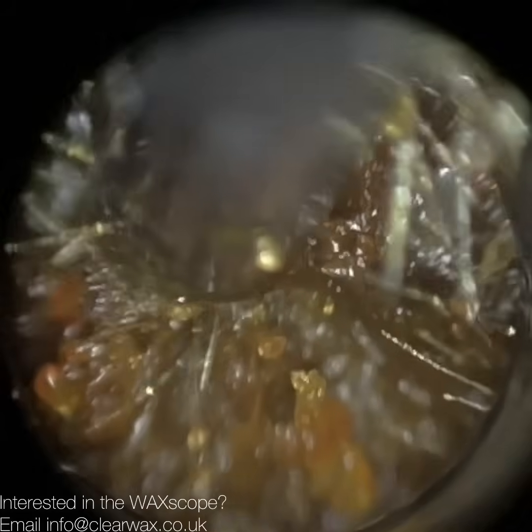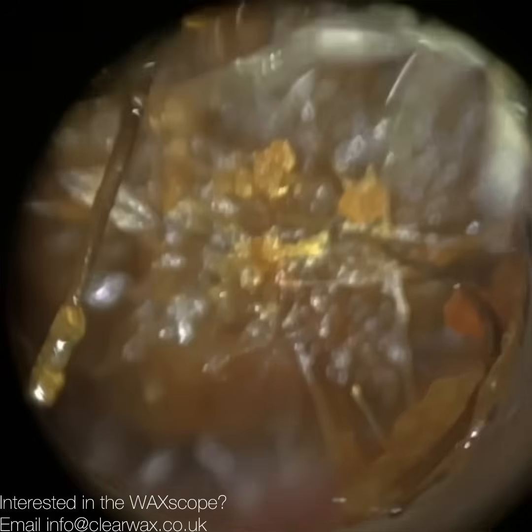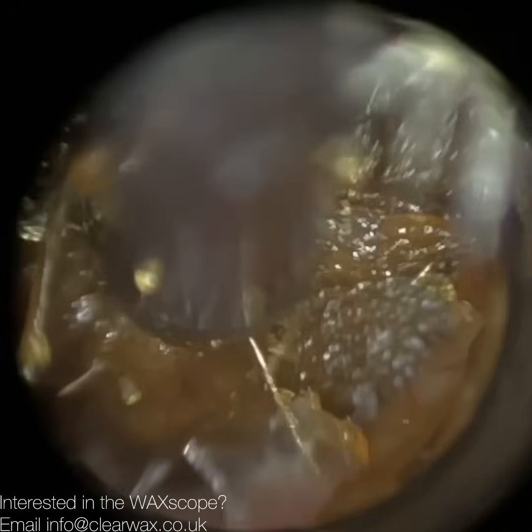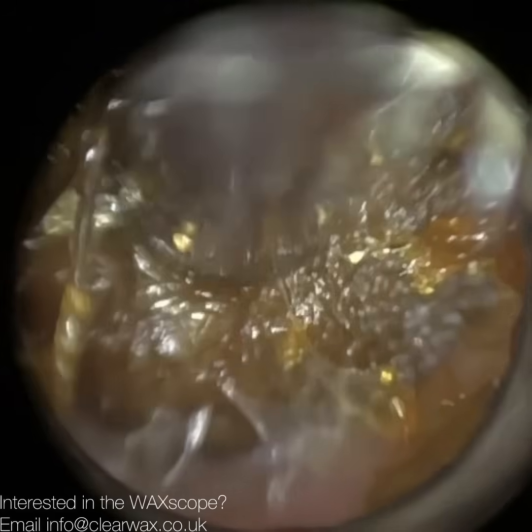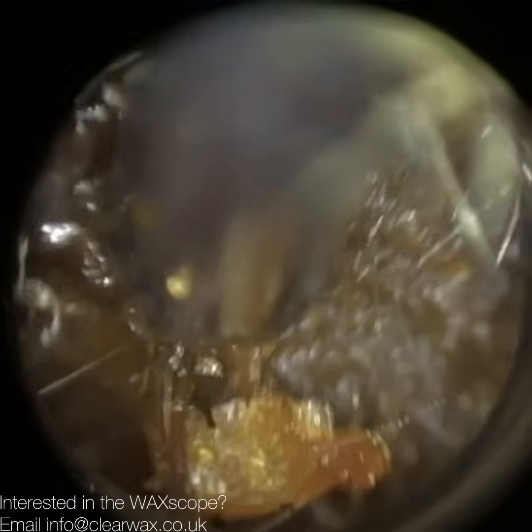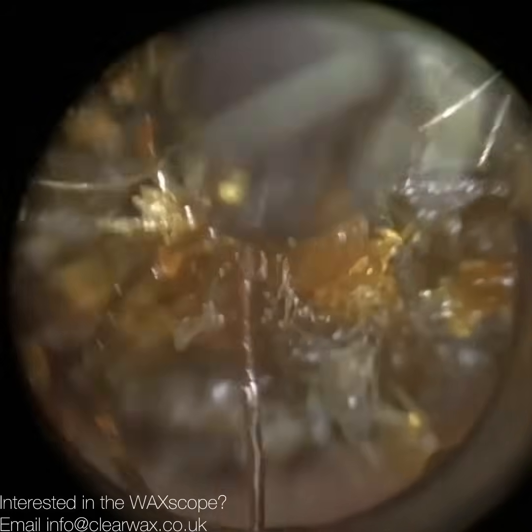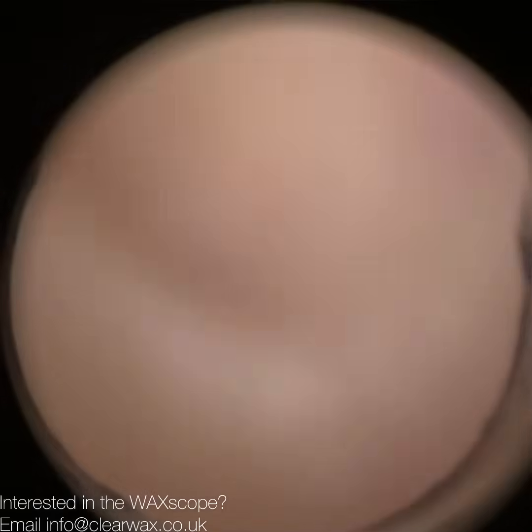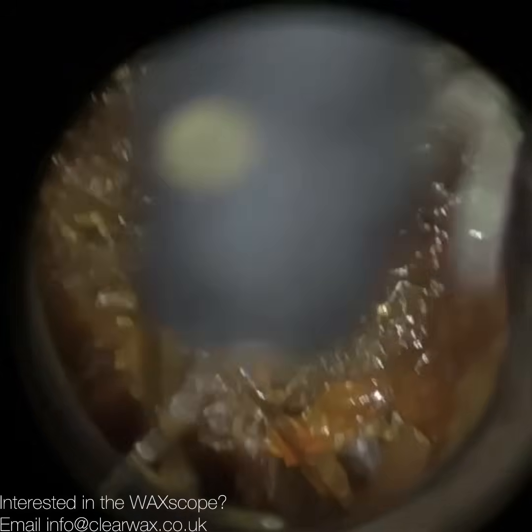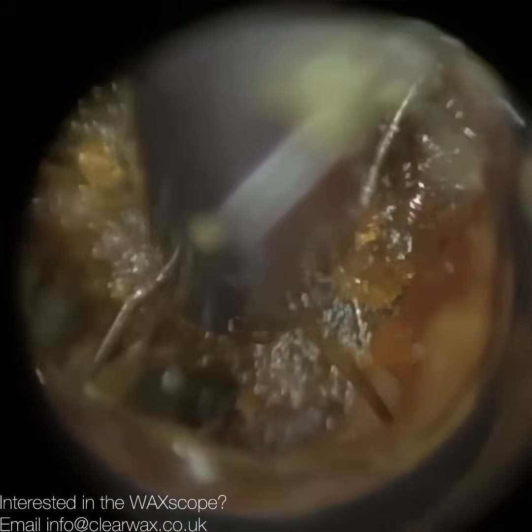In this ear there's a higher lipid concentration, and we'll classify it as therefore being a type 3 wax plug, I think. Maybe even a type 4, which is probably an equal amount of dead skin and lipids. But definitely in their right ear it is more of a keratin composition. There were still a lot of lipids in there, but more keratin. Hence, you actually saw that keratin on the flip side. When I turn the wax plug over, you'll see that sheath of keratin, that white layer of skin, and it made sense because when we're cleaning the ear, we're removing a lot of dead skin from that crater. So the left side, this impaction was more of a severe impaction in that it extended right from the entrance to the eardrum. In the right side, that plug of wax and keratin is more localized in the outer bony part of the ear canal.